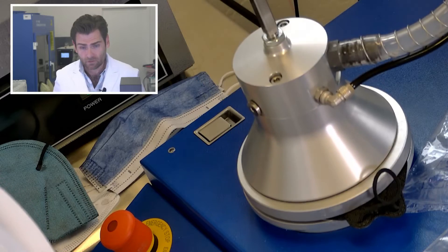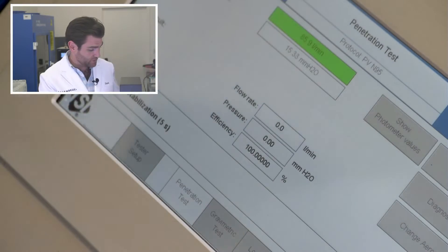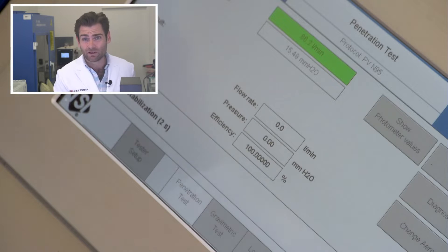Let her rip. This is a PFE machine — particulate filtration efficiency machine. We are doing the N95 test here, the same test using the same model of machine that the CDC uses to test all of their masks.